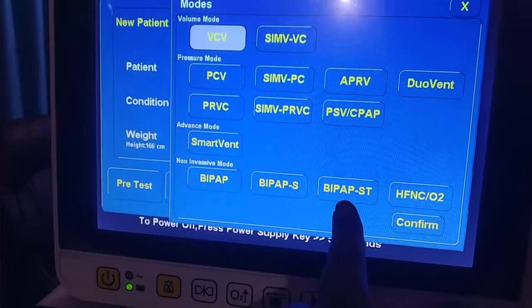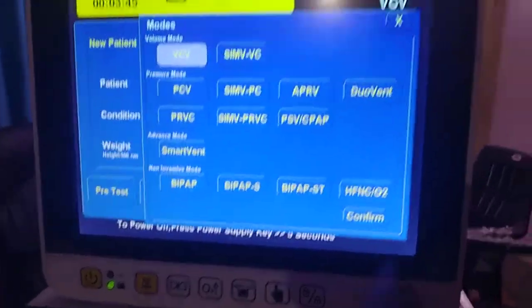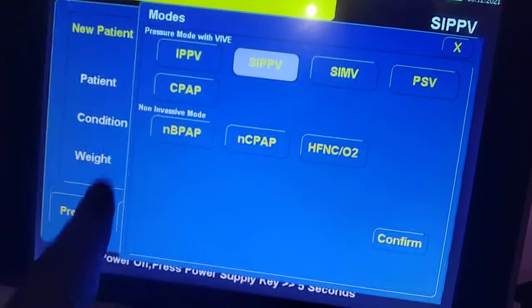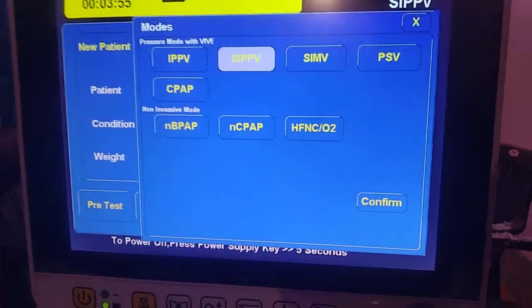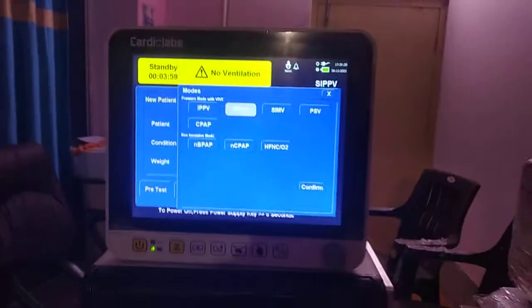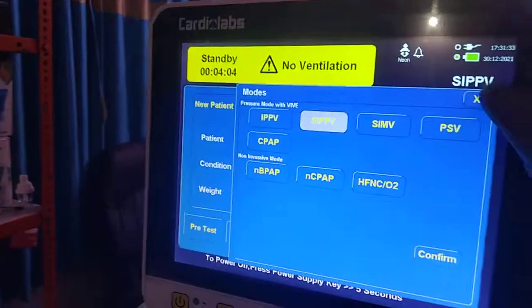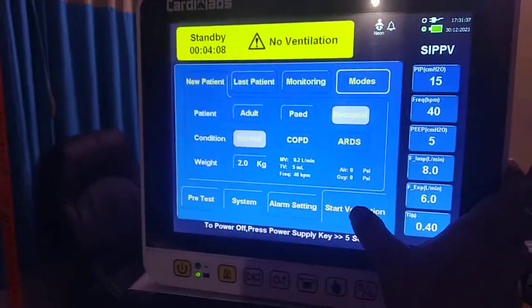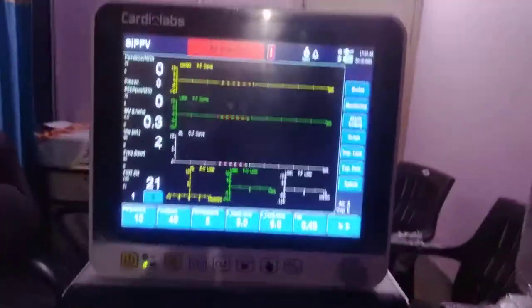You can also do BiPAP, BiPAP-S, BiPAP-ST, and High Flow. If you select a neonatal patient, you will have nBiPAP and nCPAP modes — also called Bubble CPAP — as well as High Flow. So with a single machine you can do High Flow, Bubble CPAP, and full ventilation.